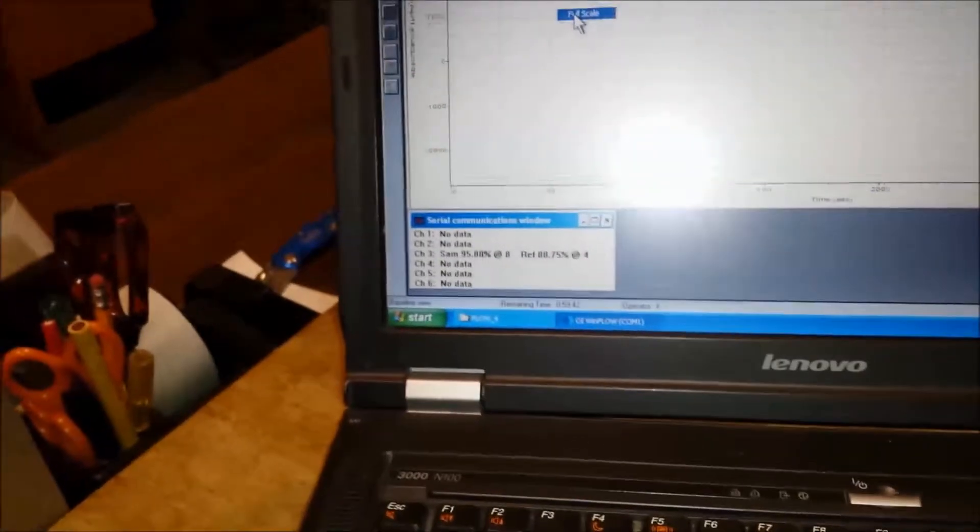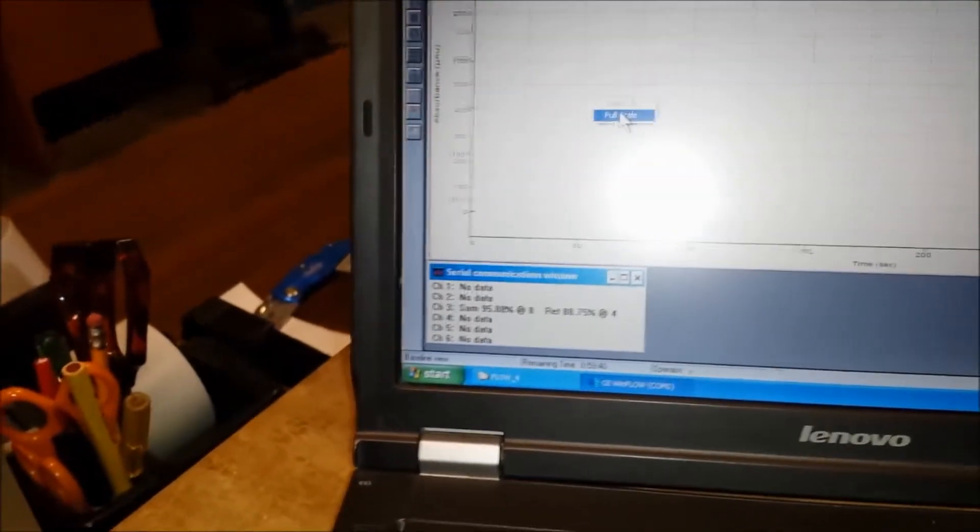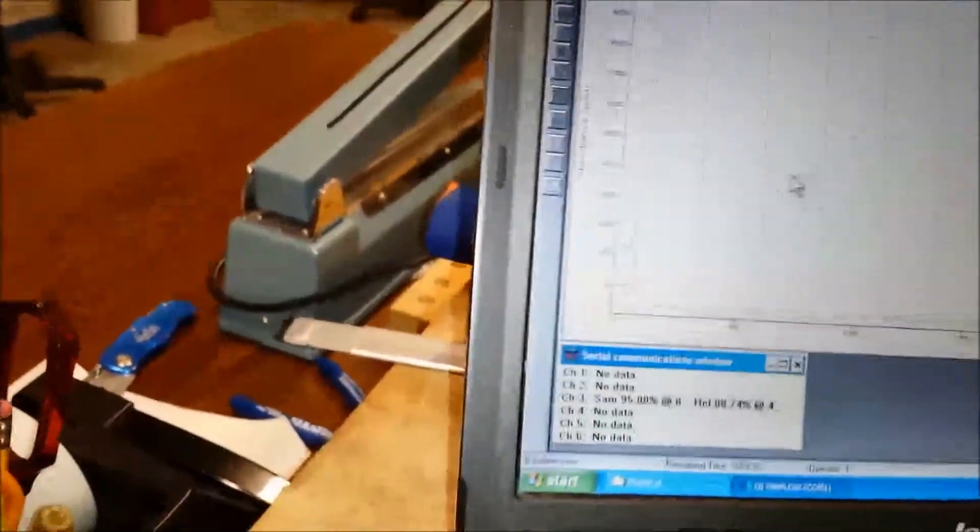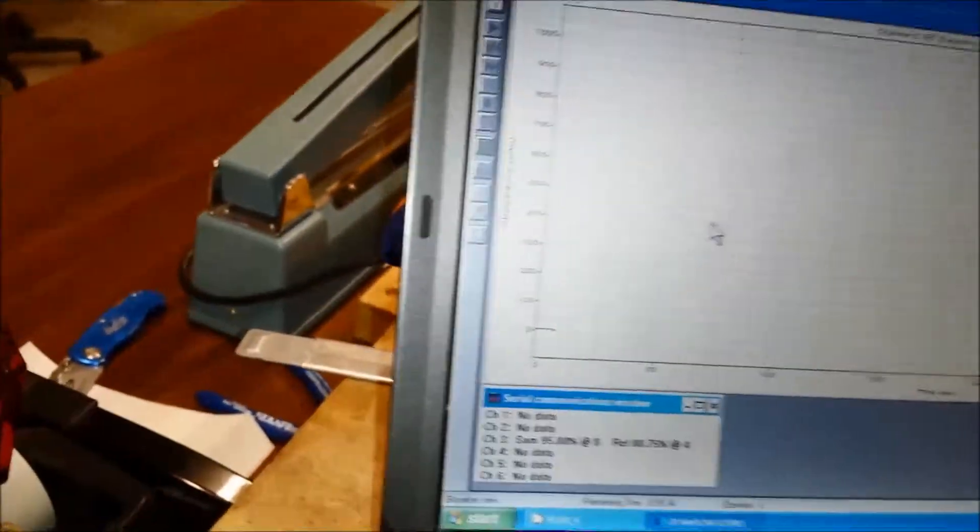And then you'll notice that this baseline now is nice and flat and coming right out of zero. So we've cleared the bubble and now we're ready for analysis.